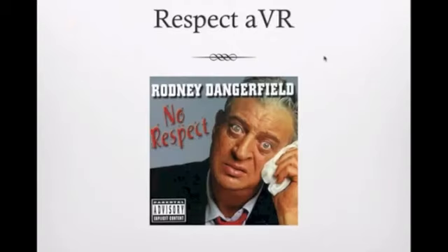So respect AVR. Use it to help you diagnose left main disease. Use it to help you diagnose PE, dextrocardia, limb lead reversal. We can use it to help us distinguish VTAC and SVT. It's a very good lead to look at, so respect it.